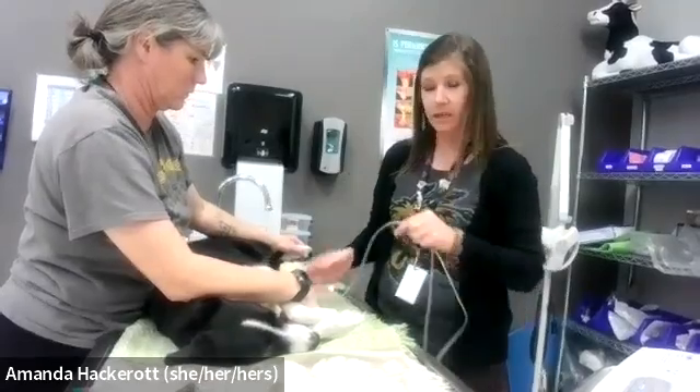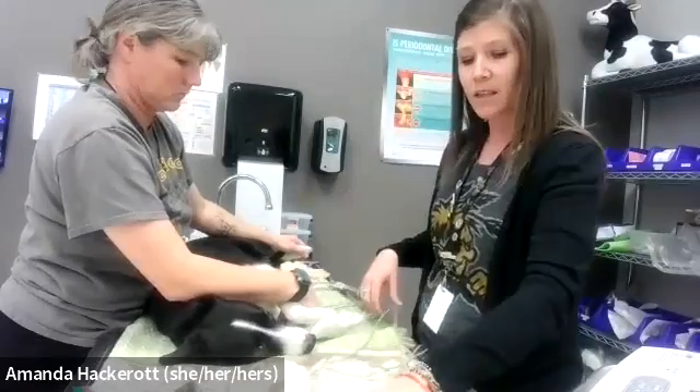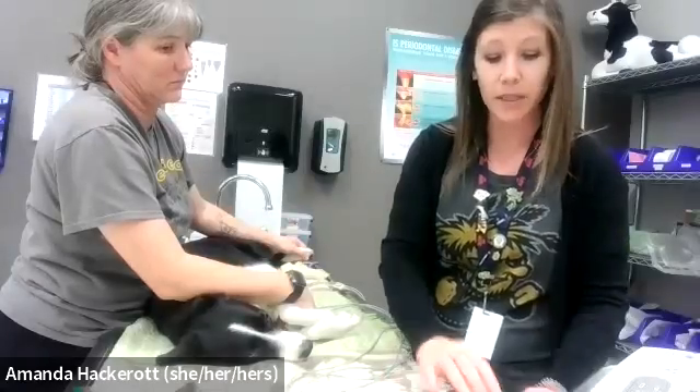Your textbook does say to put it on the distal point of the elbow, but that's quite uncomfortable for patients if you have the alligator clip type leads like we do.